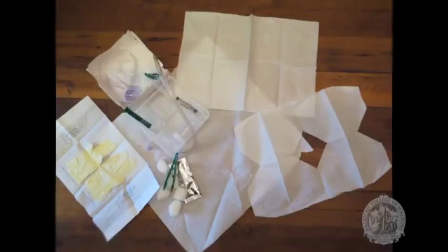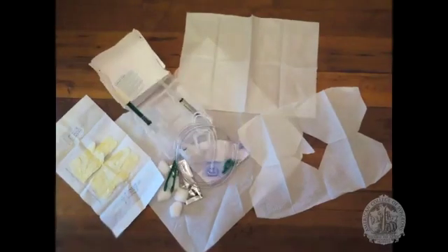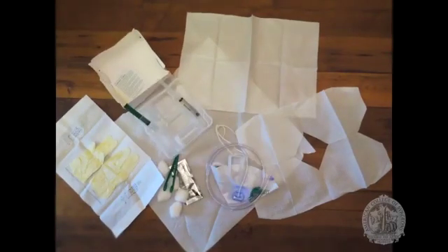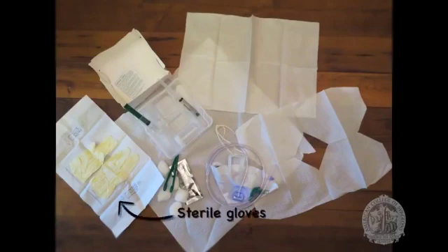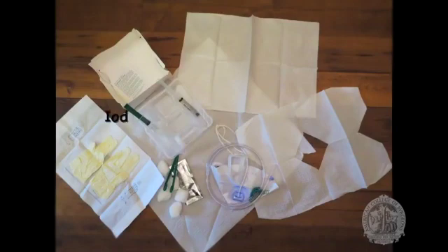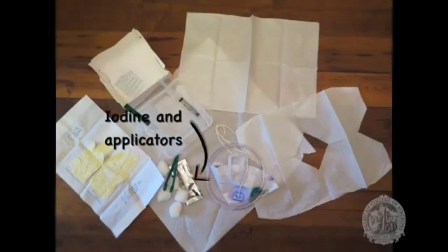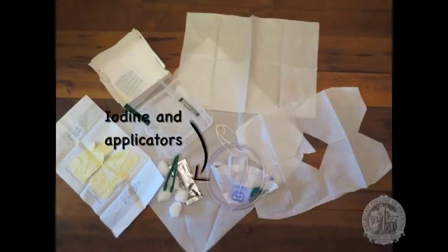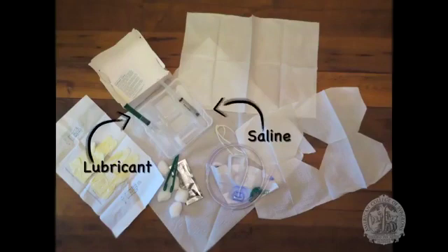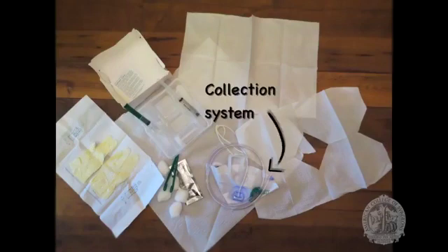In addition to the catheter, you'll need cleaning towelettes or soapy water, non-sterile gloves, absorbable pads, sterile gloves, a fenestrated drape, betadine or iodine with applicators for preparing the patient, lubricant, a sterile syringe with water or saline, and a collection system.